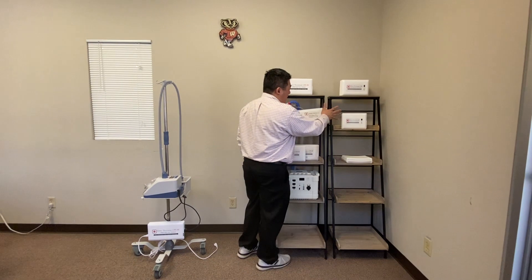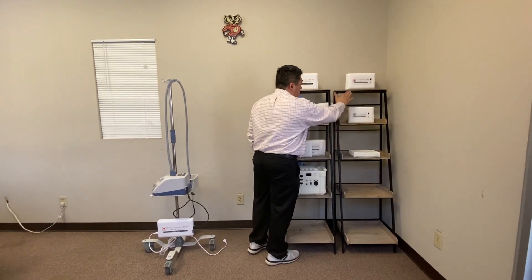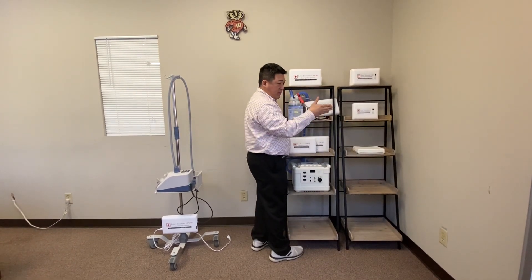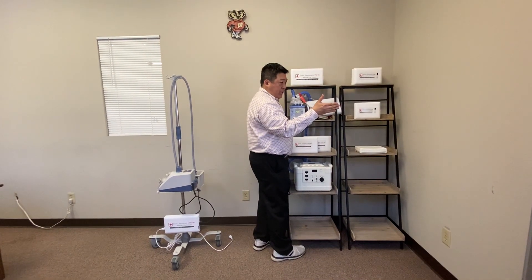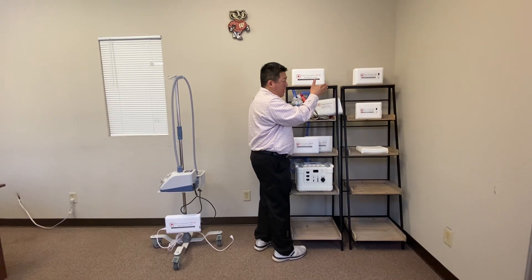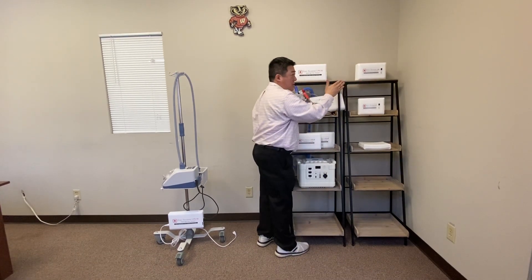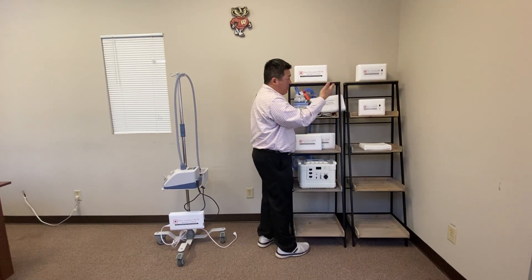For home care and rehab, we have the T180 and also the T60. The T180 can run LTV 1150 and 1200 for 9 hours. For home beds like the Trilogy 100, it runs for 24 hours. It's a good backup.